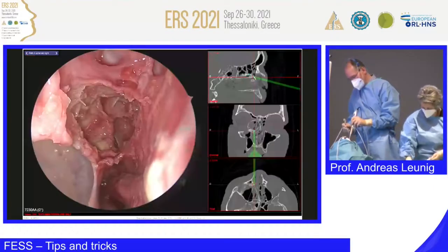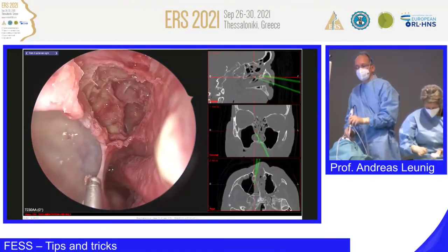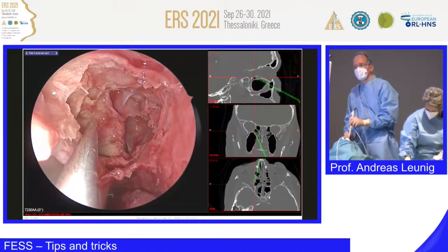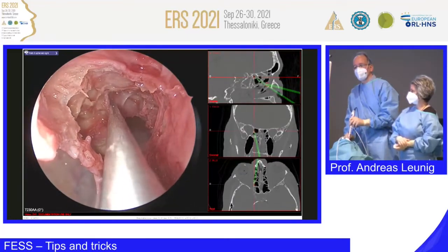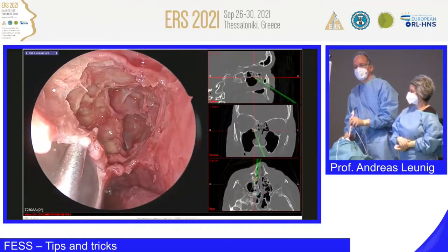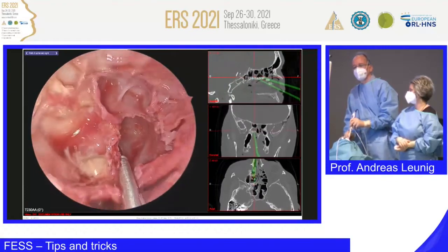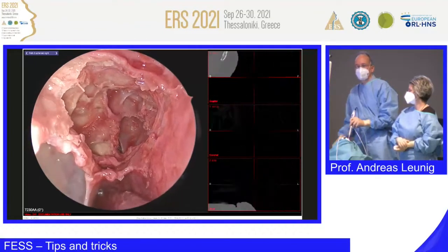Once again, for orientation, for the landmarks, you have the maxillary sinus posterior wall, you have the opening here, and the apex of the orbit, where you have to be very cautious not to injure the optic nerve, or lower, if you have an Onodi cell, the sphenoethmoidal cell, the internal carotid artery. Then we could go a little bit more laterally here. First of all, I will resect this a little bit more, Blakesley.